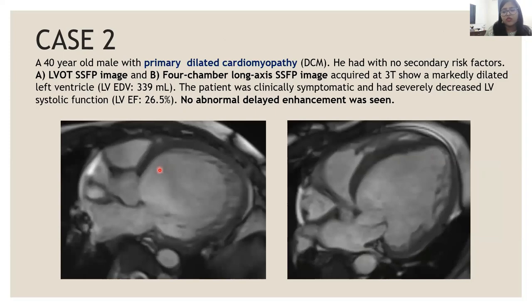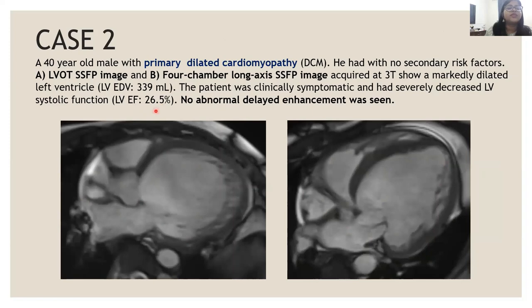The next case is a 40-year-old female with primary dilated cardiomyopathy and no secondary risk factors. The LVOT-SSFP image and 4-chamber long-axis SSFP image show a markedly dilated left ventricle with an end-diastolic volume of 339 ml. This patient had severe systolic dysfunction with an ejection fraction of only 26.5%, but on post-contrast imaging, no abnormal delayed enhancement was seen.